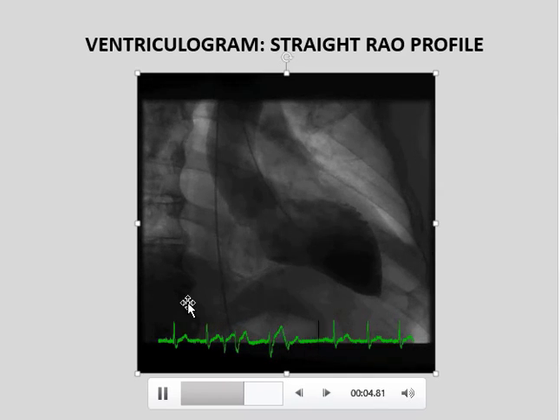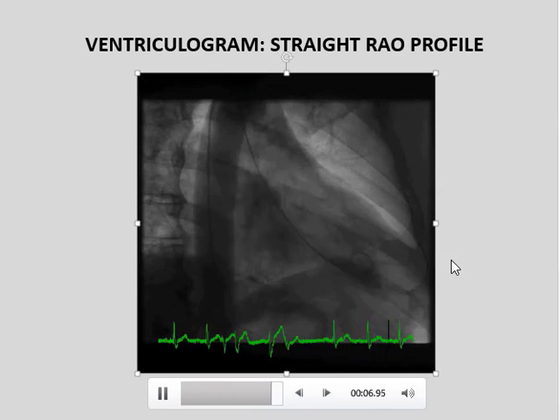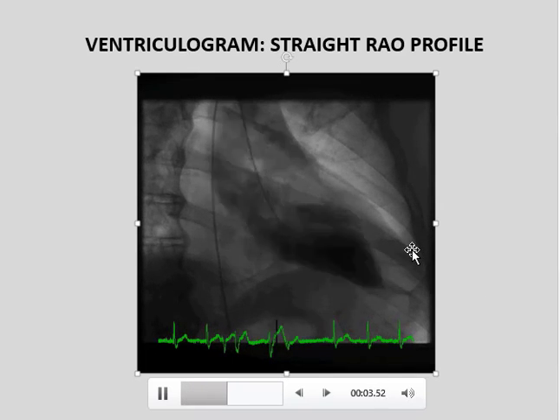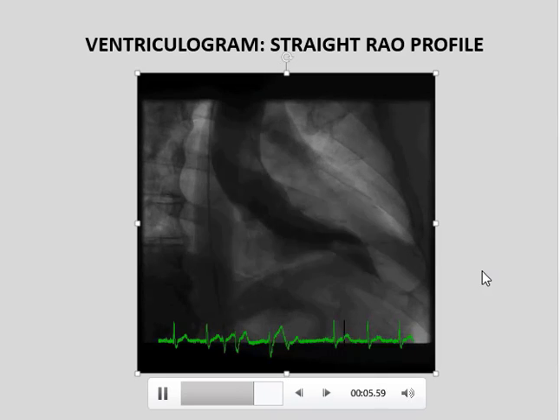In this view, what I call the cardiac profile, the left ventriculogram in profile, you see the backbone is on the patient's right and the ribs slowed down to the patient's left. And we see the heart in that elongated profile, what I call the profile.